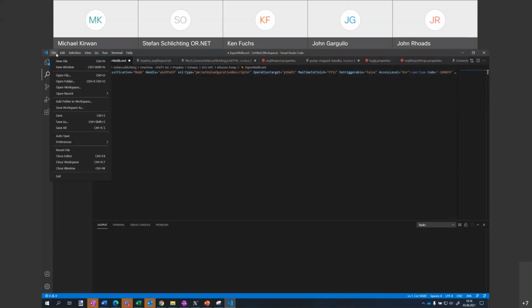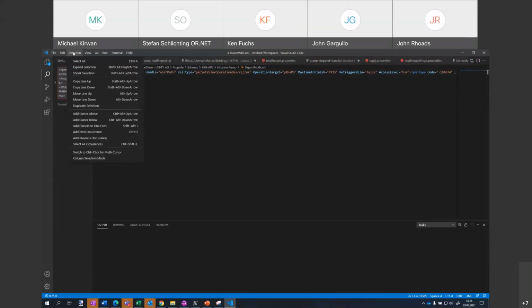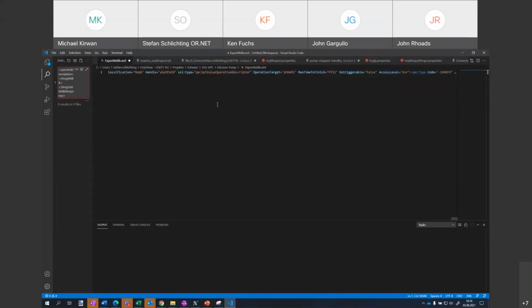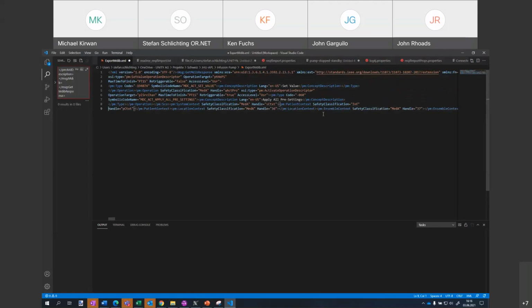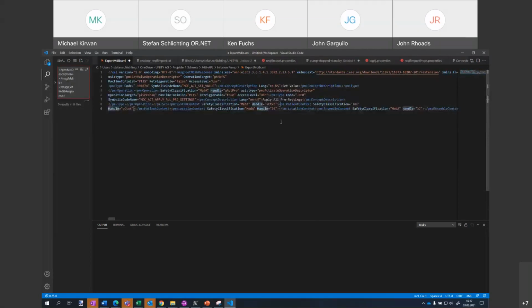It's an XML file, yes. So it should be able to format it. I have no clue. Well, it doesn't. I don't know why. But what you can see here, and I'll just do poor man's formatting, is it hammers out the whole XML that basically represents the MDIB as we just have defined it. I don't know how many characters it has, but it's quite a bunch. It's about 6,000 characters in there. So it should be the whole document.